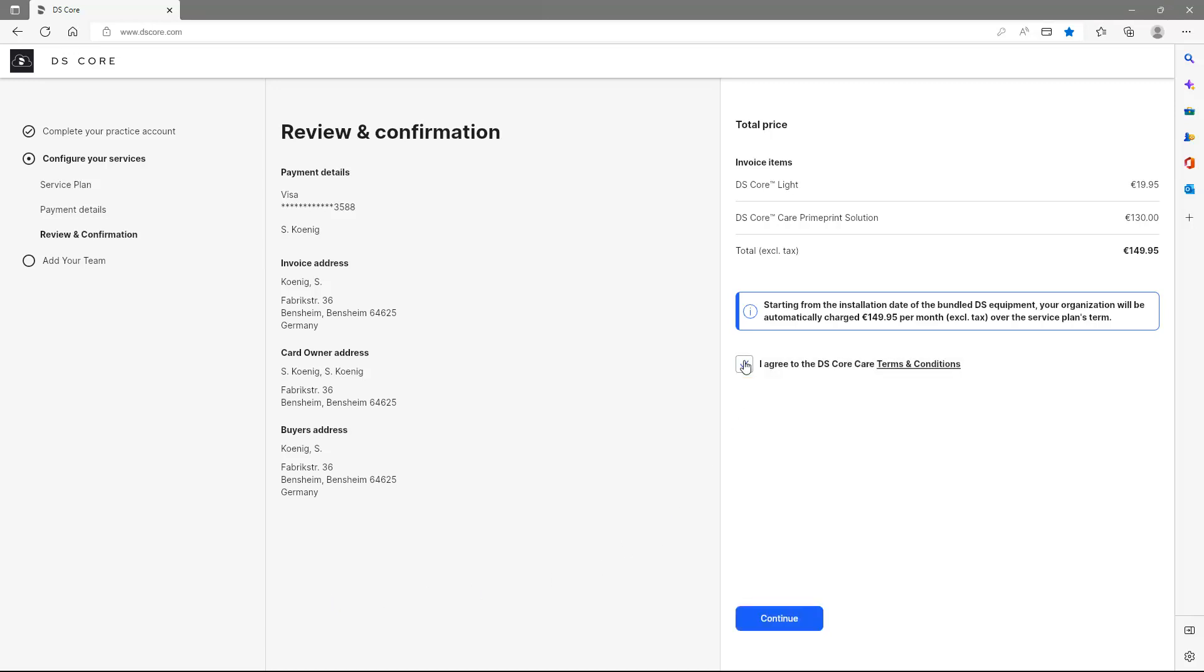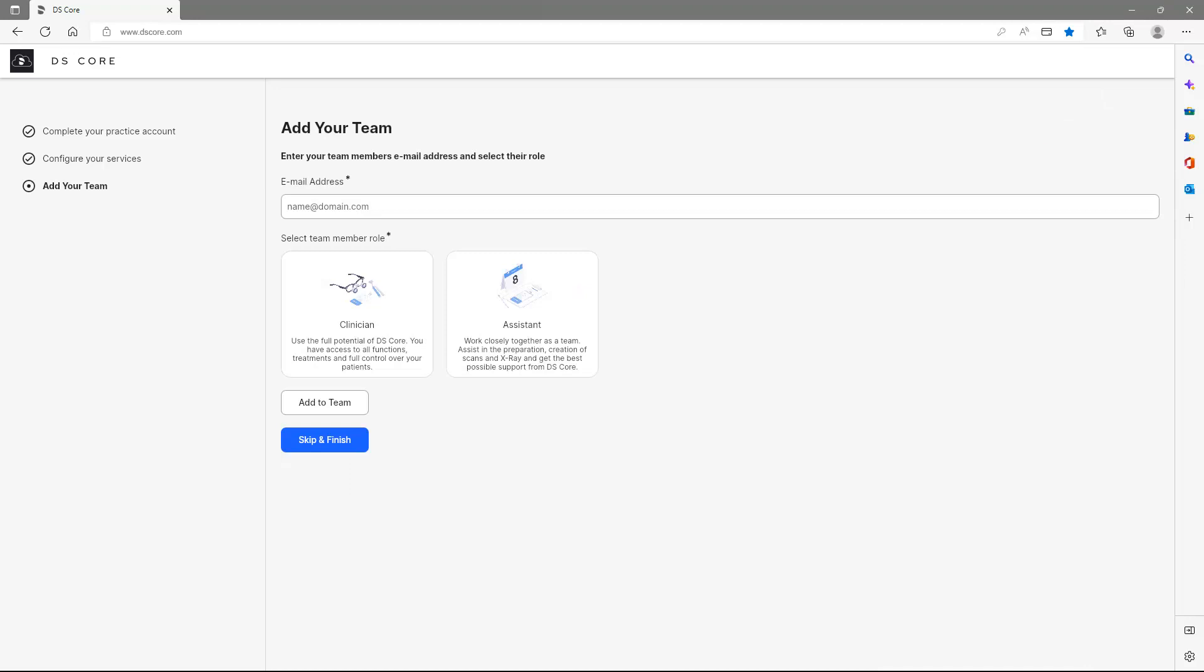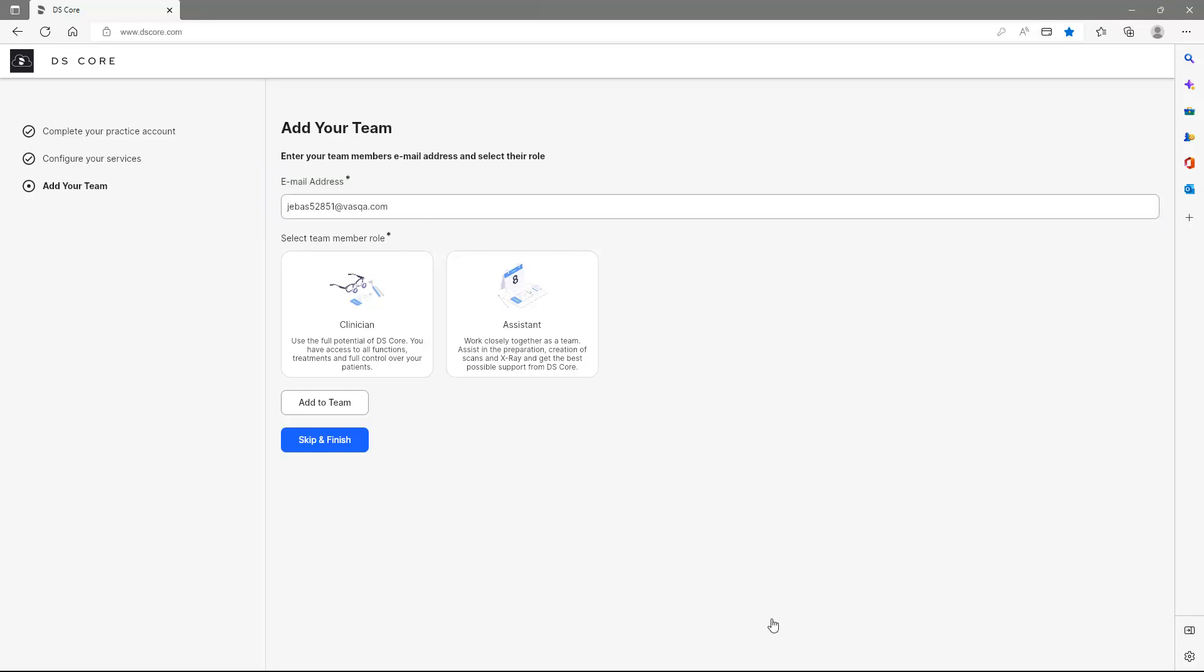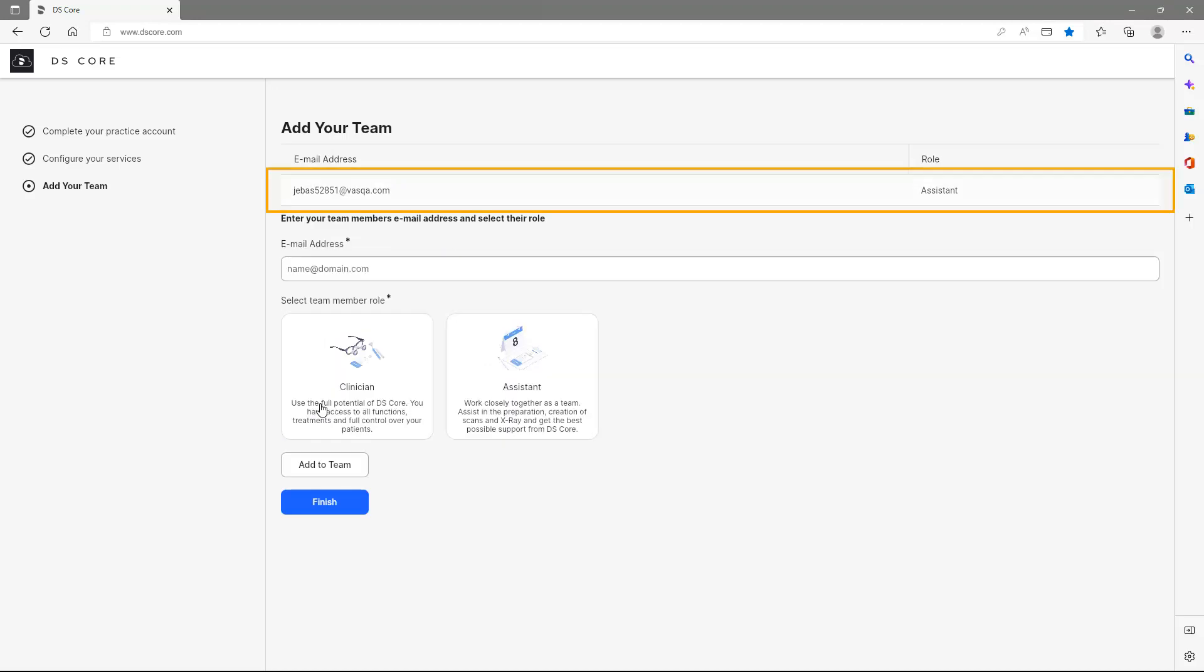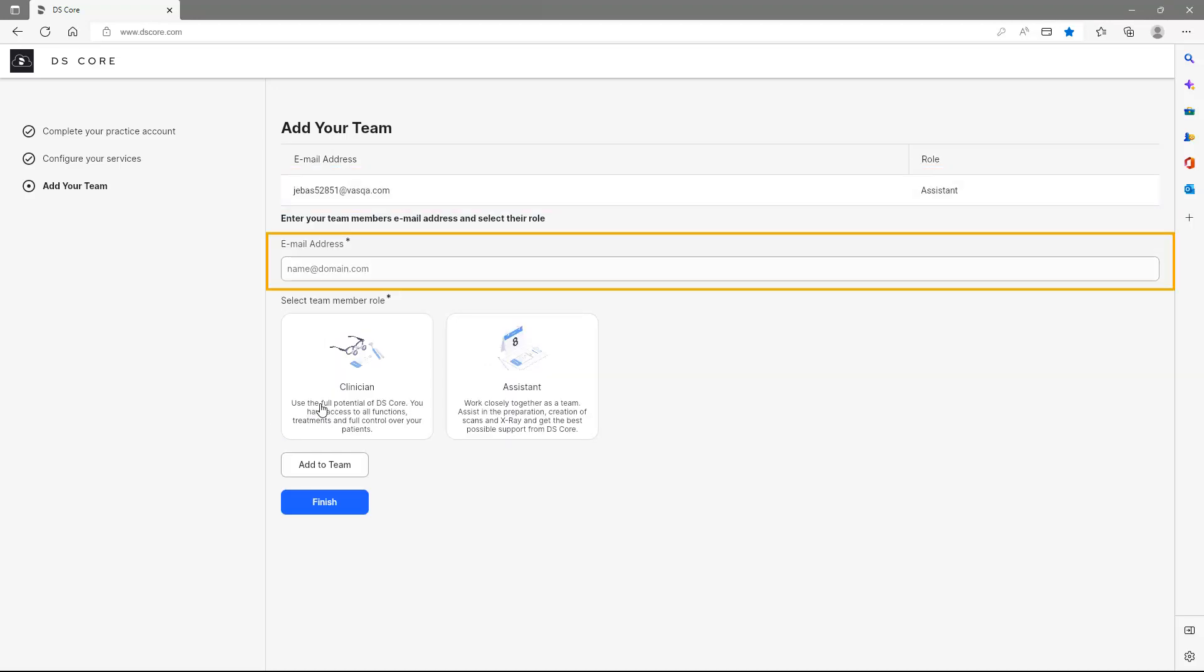By tapping Continue, we get to the last step where we can add team members. Under Email Address, we enter a corresponding email address and select the role of the team member below. After tapping on Add to Team, the email address appears and we have the possibility to invite further team members.